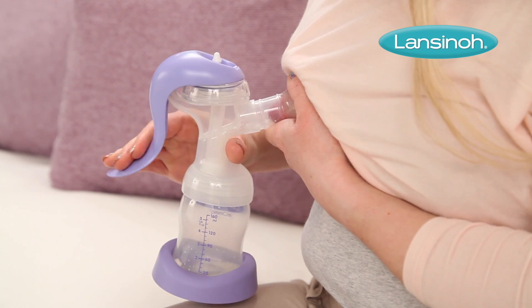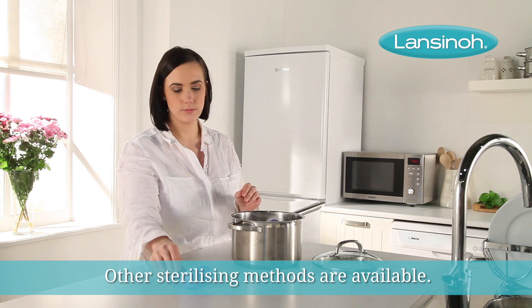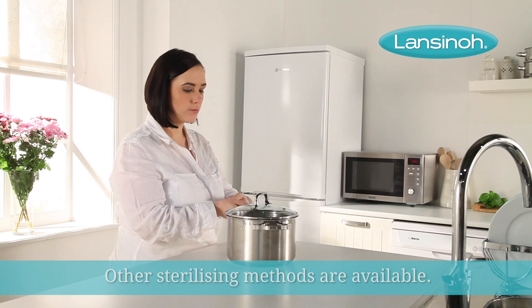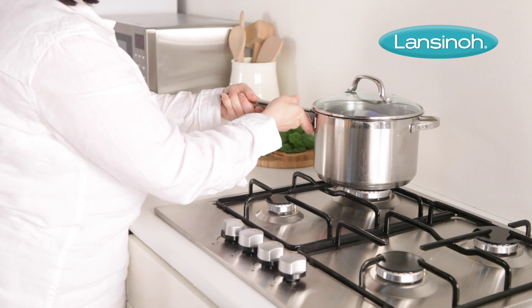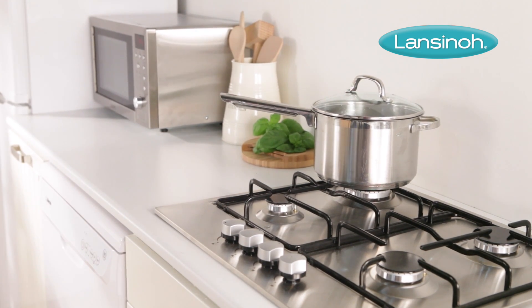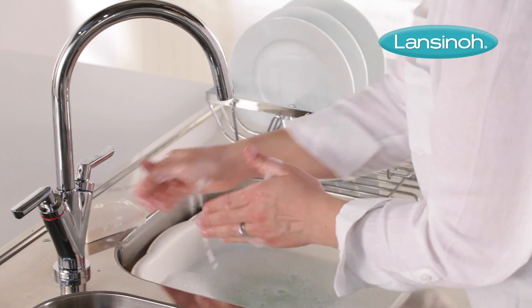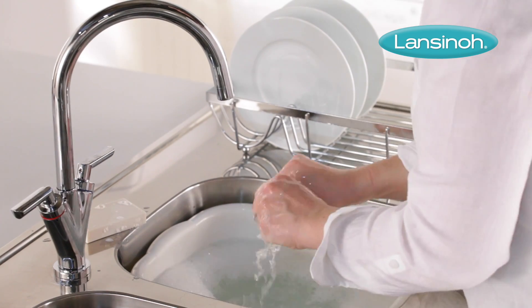You can sterilise the pump by using boiling water. Simply place all parts in a pan of boiling water, ensuring no air is trapped in any parts and that enough water is being used to keep the parts floating freely. Boil for at least 10 minutes. Keep the pan covered until the equipment is needed. Always wash your hands thoroughly with soap and water before handling any of the pump's parts once they have been cleaned or sterilised.